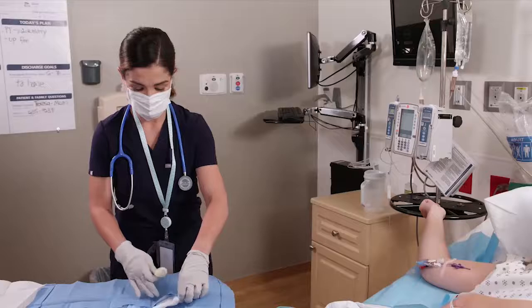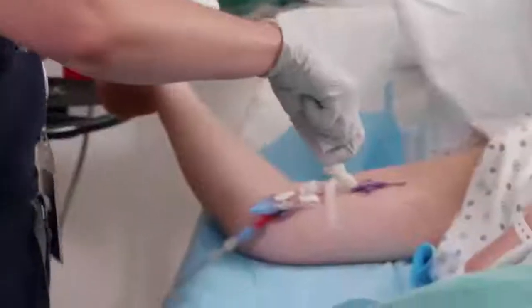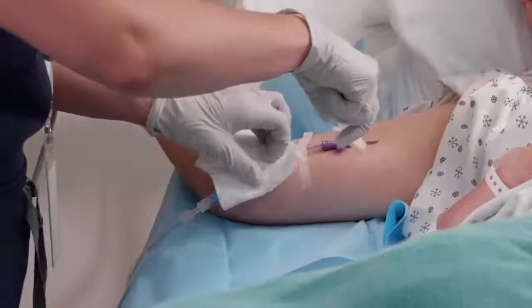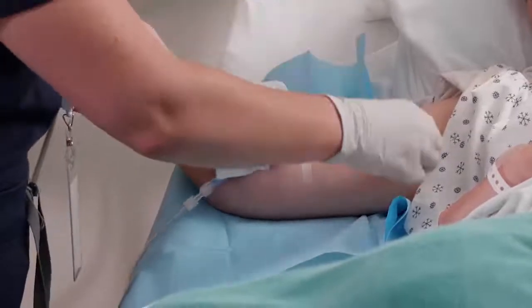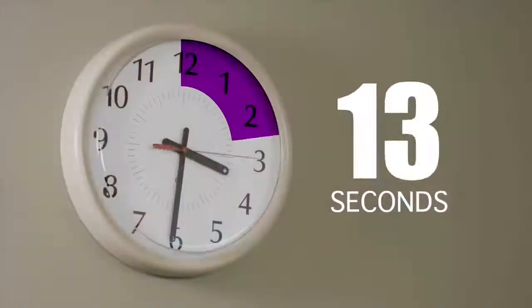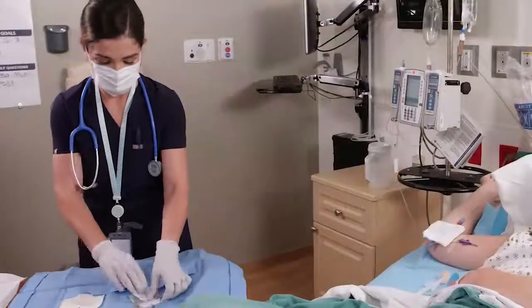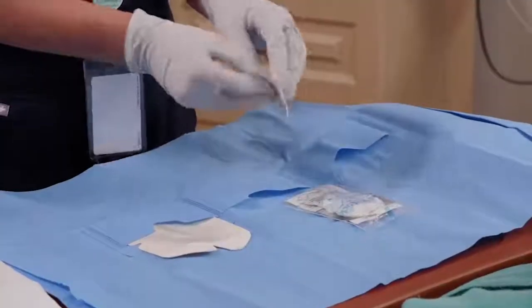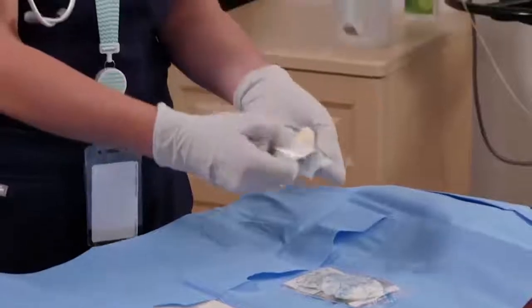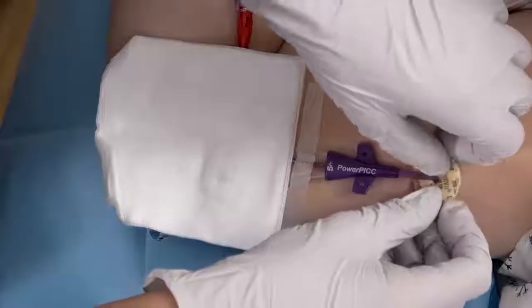Next, clean the skin using back and forth scrubbing motion for 30 seconds and let solution dry completely. If using an antimicrobial disc dressing, align the dressing slit in line or just off-center of the catheter.